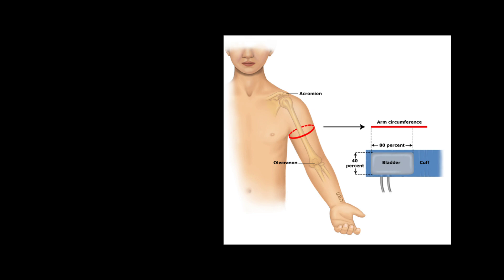Choosing a correct blood pressure cuff size is important to get a correct reading at measurement of blood pressure. This is very important in pediatrics. So now let's see how we get the correct blood pressure cuff size.